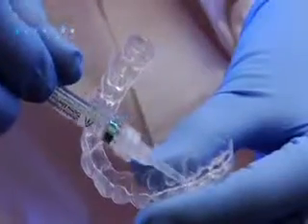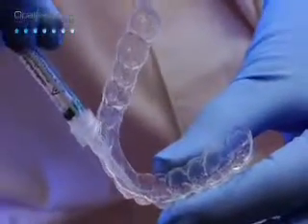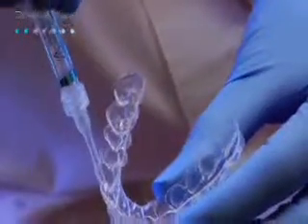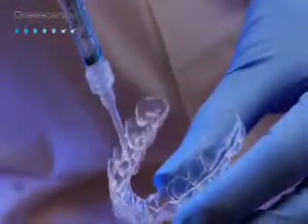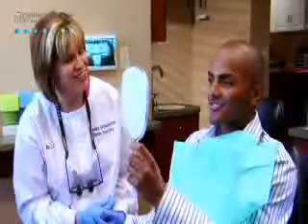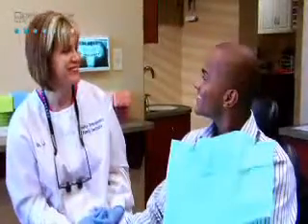Load the tray by expressing one continuous bead of gel approximately halfway up from the incisal edge on the facial side of the tray from molar to molar. This should use about 1/2 to 1/3 of a syringe. Place tray over teeth and gently press the tray to move the gel into place. Next, gently wipe off excess gel with a toothbrush or clean, moist finger. The patient will leave the tray in for a period of time recommended by the dentist.